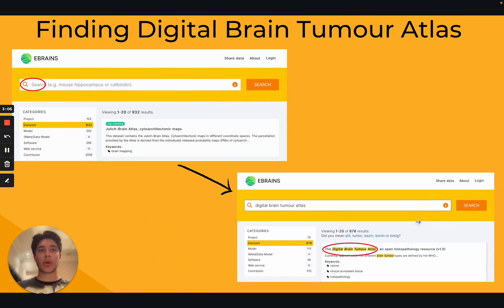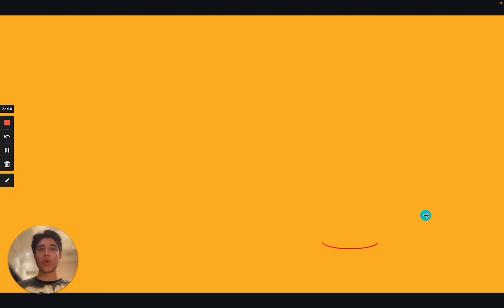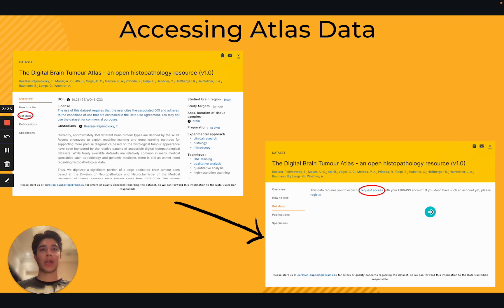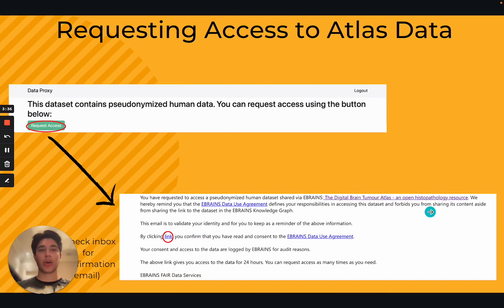From there, type 'digital brain tumor atlas' into the white search bar at the top of your screen and click search. The first result should read 'The Digital Brain Tumor Atlas, an open histopathology resource.' Click on the title of this search result, then click on the heading that says 'get data,' located two headings below the overview heading, and then click the blue link that says 'request access.' Confirm your request by clicking the green 'request access' button. You should then receive an email with a blue link to be redirected to the page containing all of the files in the digital brain tumor atlas.